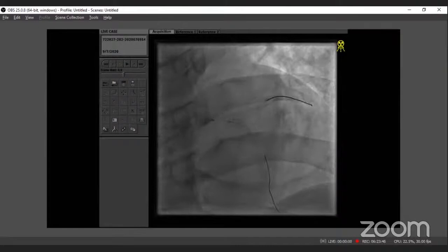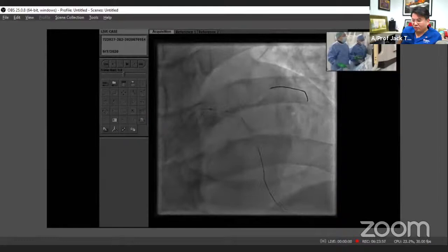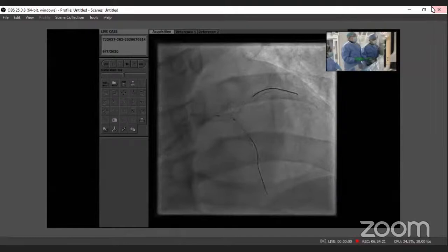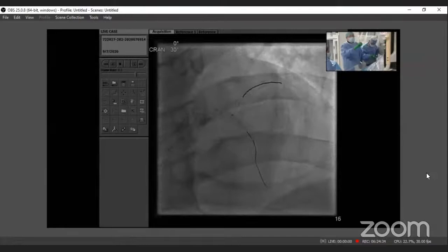For the fellows' sake, when this happens, how do you tell whether this is wire wrap or the stent is not well apposed? Is there any way to tell? If you're not sure whether your wire has gone under the stent or is in the lumen, one easy way is to take a very small balloon and see whether it goes down. Don't push. If it is wire wrap, you can gently inflate the balloon to push the wire apart and then gently push down. So that's what we did.